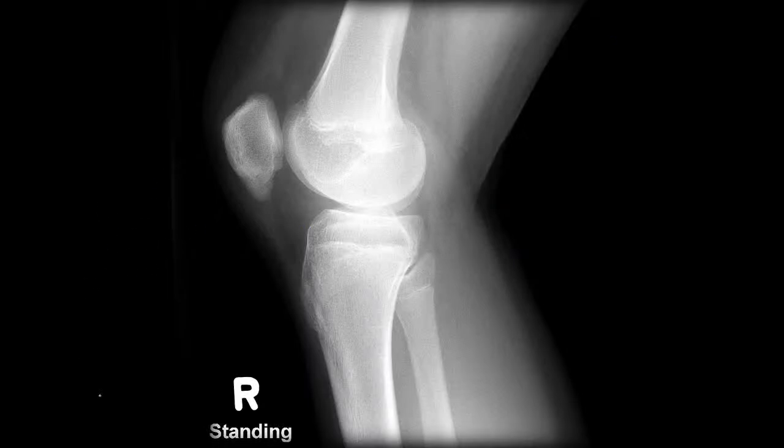Now guys, moving on to the next image. Okay, so there is osteochondritis of the tibial tuberosity. You are going to find soft tissue swelling just anterior to the tibial tuberosity, and you can also find inflammation. Okay, fluid collection in the infrapatellar bursa. It can also result in bursitis of the infrapatellar bursa.